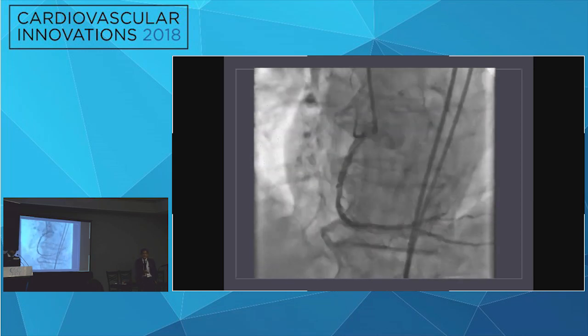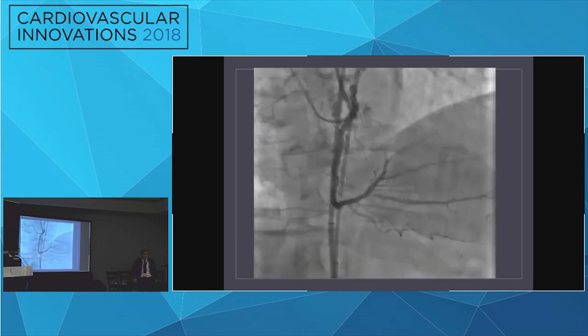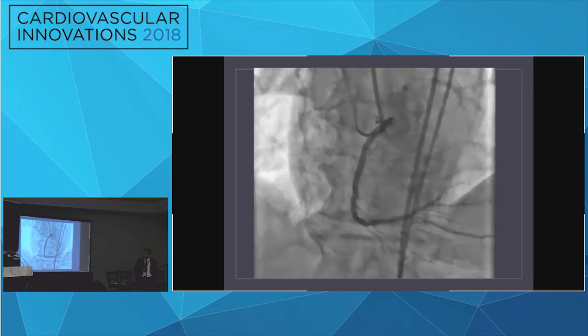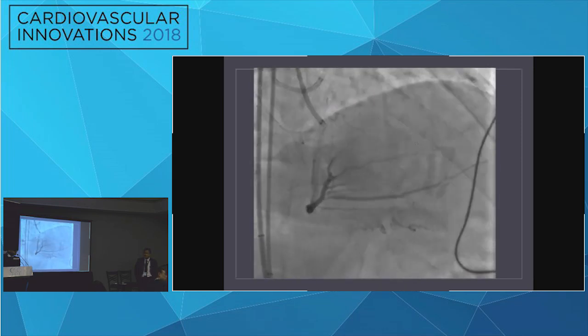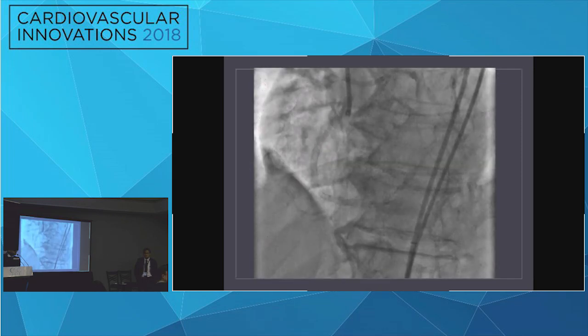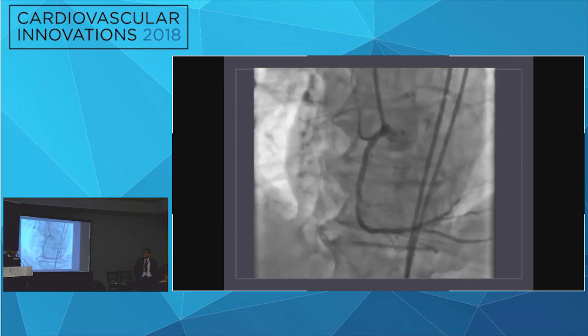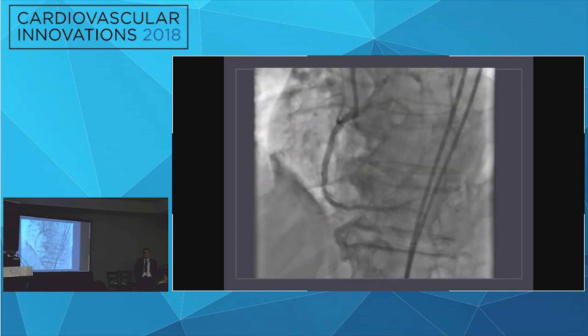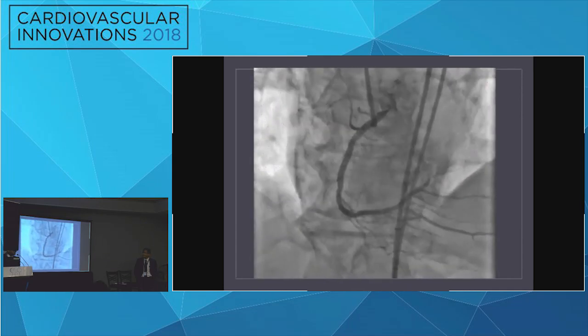Next case. Thank you. I want to amend the same thing that Mauricio was mentioning about intravascular imaging. There's a recent paper from Dr. Brilakis showing how rarely it is used in CTO situations and how often it changes the stent sizing. Absolutely. Especially your LAD and also your bifurcation, I'm a little bit worried it might be underexpanded.